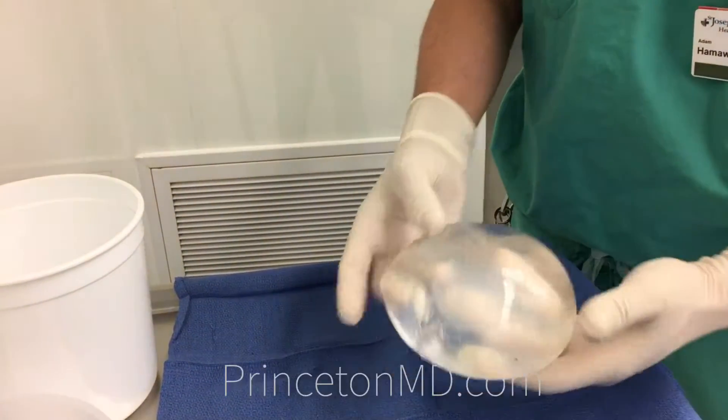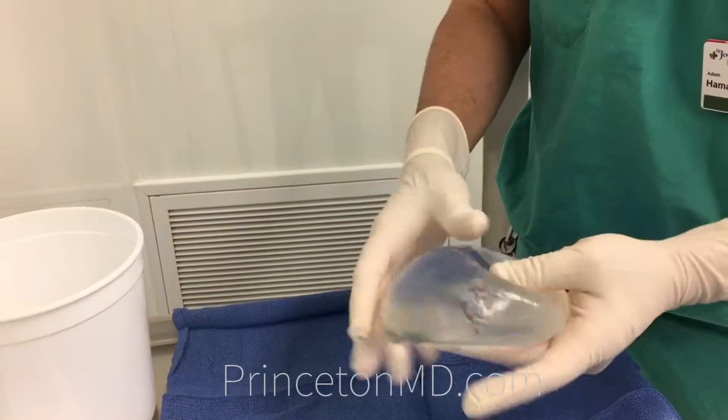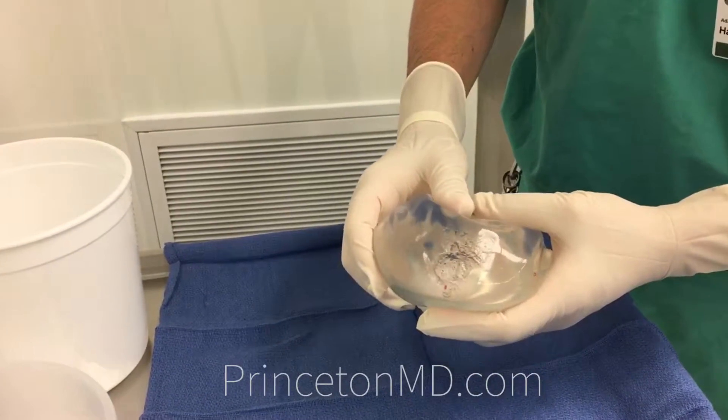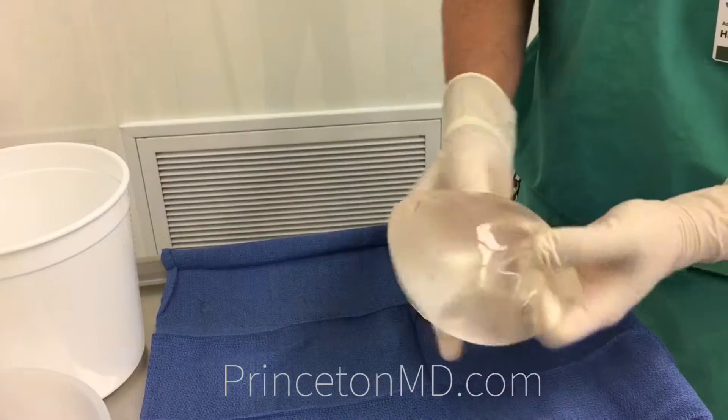So we got a ruptured implant. You can see that even though it's ruptured, it's not leaking all over the place. It's held its form. You push it out and it all pops back in. So these new implants are pretty safe.